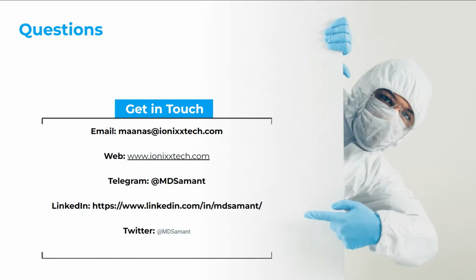But yeah, you could definitely look at your software, and if you need a checklist, I can help look through one or provide you with one. But if you look at the definition, it's based on a general purpose computing platform, which could be your phone or whatever. It's basically not based on a hardware medical device. So if it's not firmware on your device, and you are able to use it on your phone, for example, your phone's a general purpose computing platform, and you could look at all those pieces to make sure it's not a medical device.